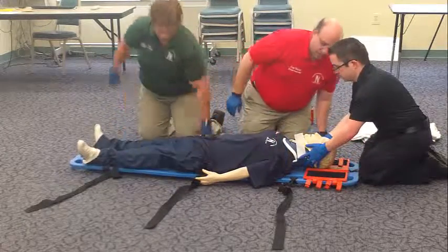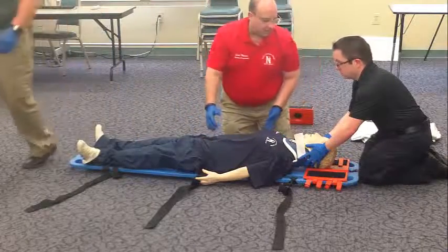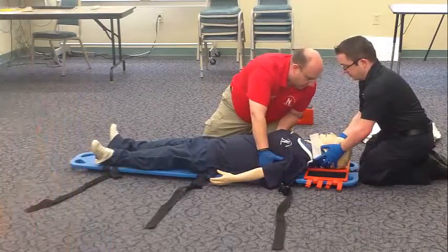I will check and ensure that the patient is centered on the board. We can come up a little bit. On your count, let's move straight up. One, two, three. That's good.